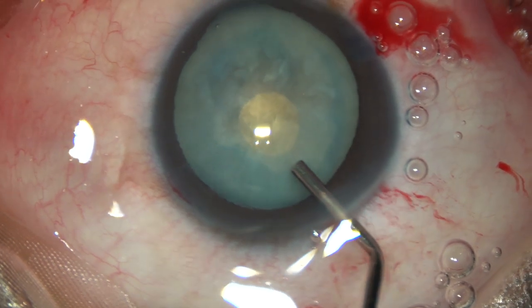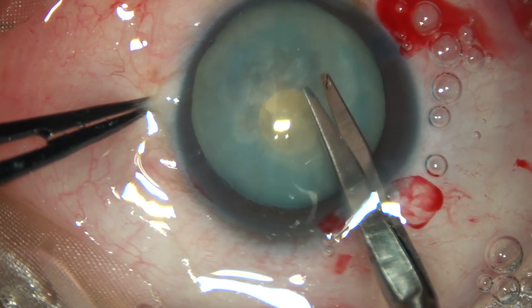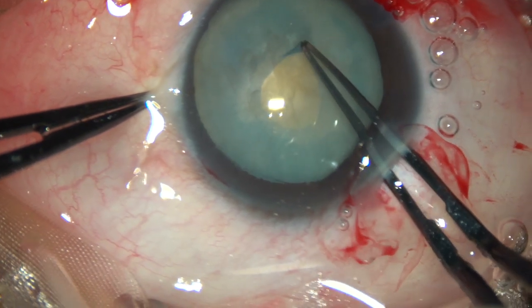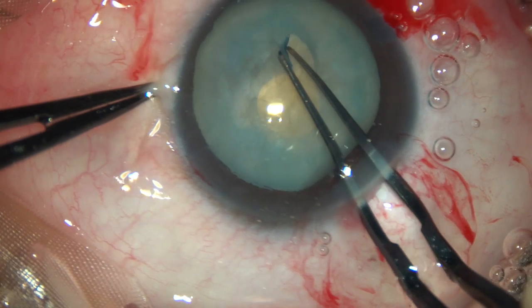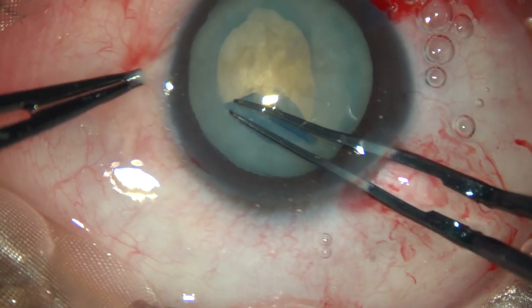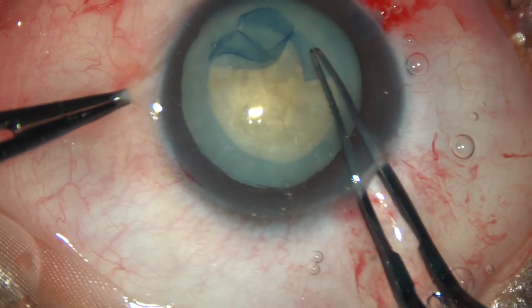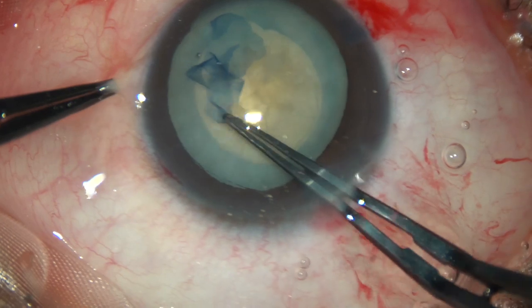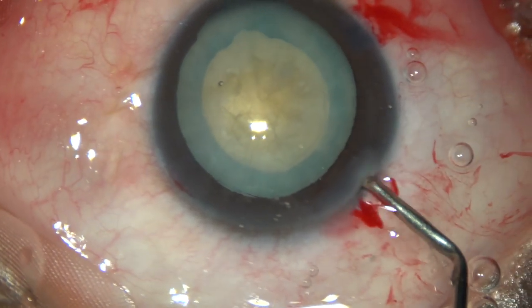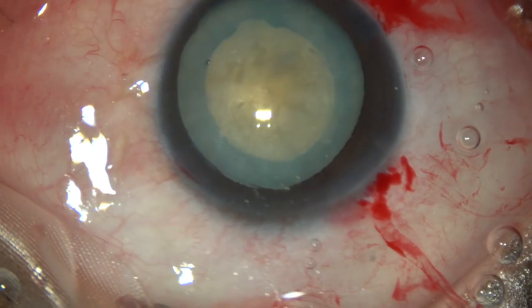Now 2% HPMC is injected again. A Vannas scissor is taken. A small cut is made at the margin of the mini-rhexis at around 8 o'clock. Utrata forceps is then used to hold this capsular tag and do a continuous curvilinear capsulorhexis of adequate size. In coloboma iris, at the area of coloboma, there can be zonular dehiscence. If I notice zonular dehiscence, I put a CTR, but in this case, since there was no zonular dehiscence, CTR was not required.